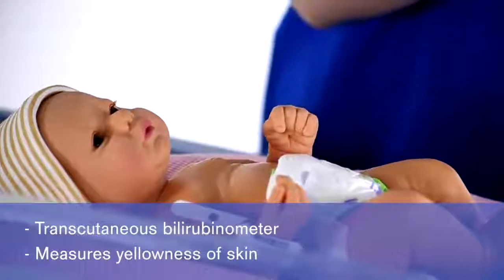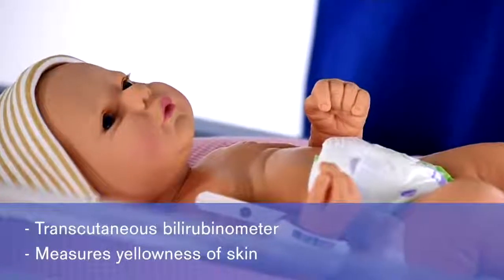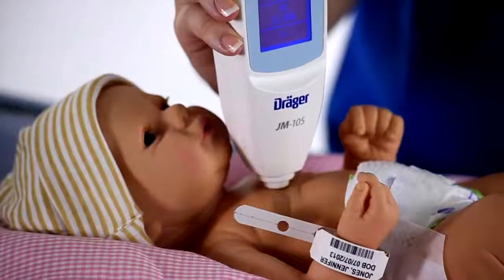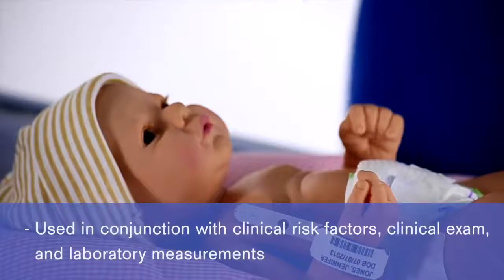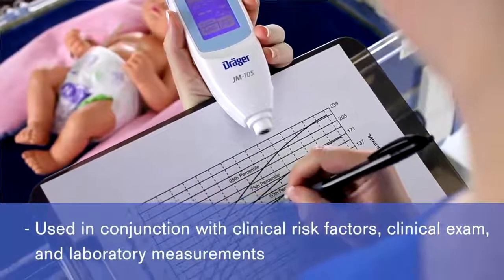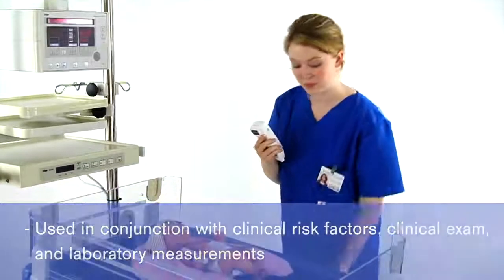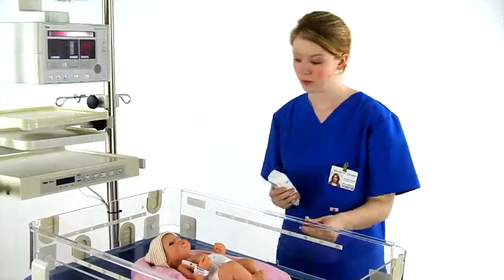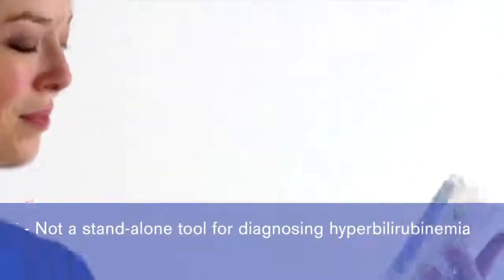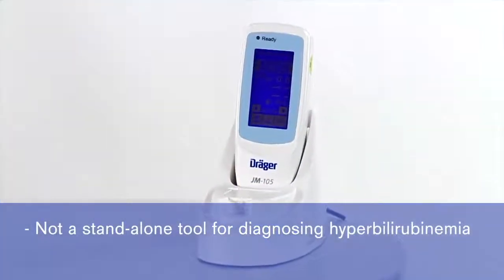The JM105 is a transcutaneous bilirubinometer. It measures the yellowness of the infant's skin, providing a digital value that correlates with total serum bilirubin levels. The JM105 is a screening tool that is to be used in conjunction with clinical risk factors for hyperbilirubinemia, clinical findings, and laboratory measurements to assist in making decisions about patient care. The JM105 can help identify which infants require a serum bilirubin measurement, but is not a standalone tool to diagnose hyperbilirubinemia.